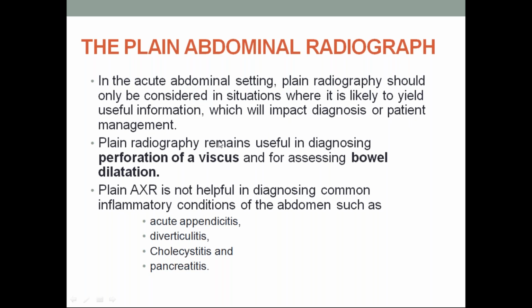The plain radiography remains useful in diagnosing perforation of viscus and assessing bowel dilatation. Please make a note of this. The plain abdominal radiography remains useful in diagnosing perforation of the viscus and for assessment of bowel dilatation during intestinal obstruction, intussusception, or some other conditions which may lead to bowel dilatation. In perforation of viscus, we will see a pneumoperitoneum.